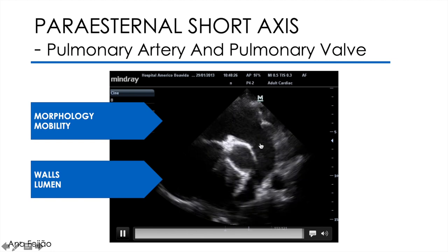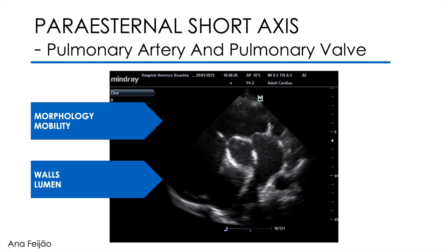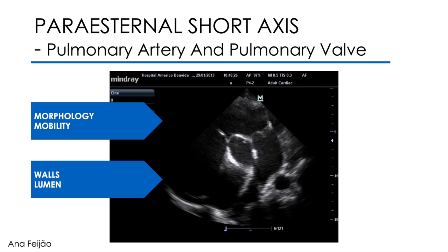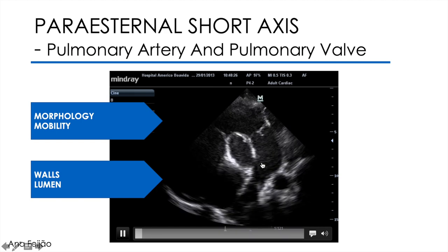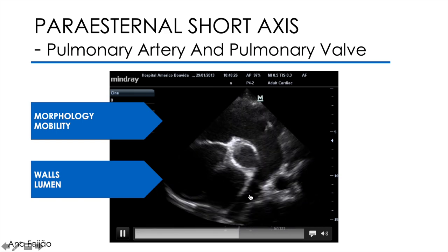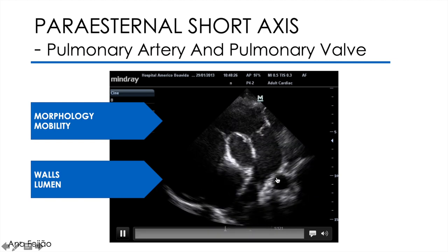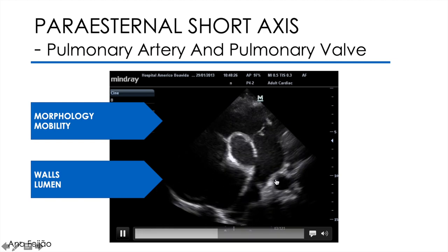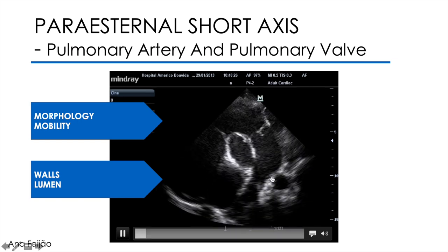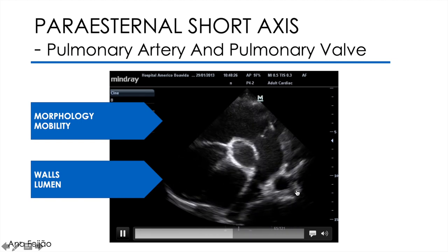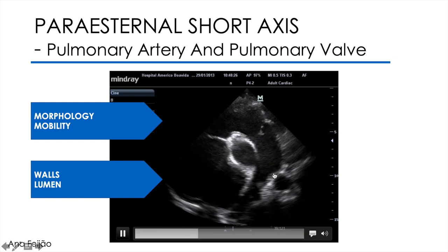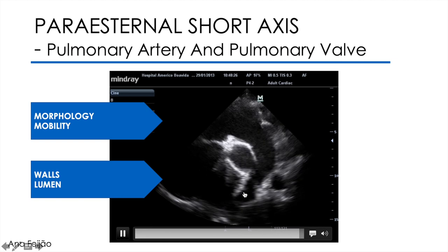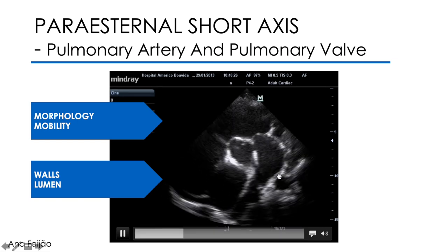After evaluating the mobility of the pulmonary valve, I pay attention to the main pulmonary branch and the right and left branches. In this image, the bifurcation is not very noticeable as there seems to be a membrane between the main branch here. So if you tilt the probe a little, it will adjust and we'll be able to see the continuity from the main branch to the secondary branch. I access the walls and do some tilts with the probe to see if there are no strange echogenic images, especially in the lumen.